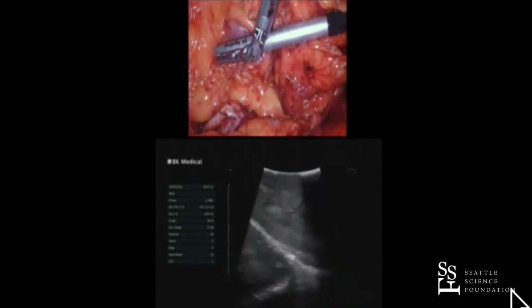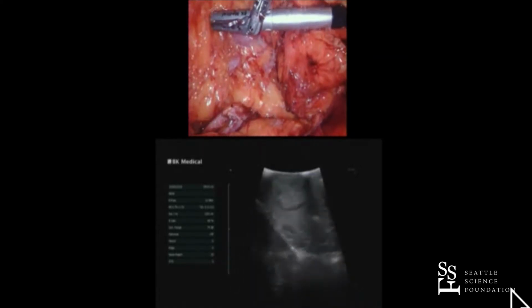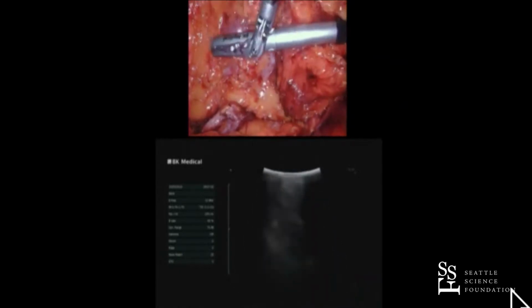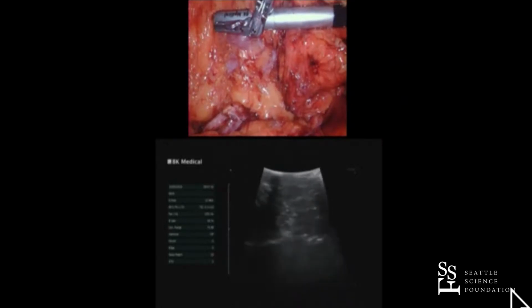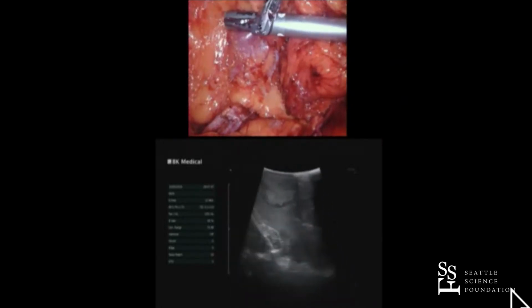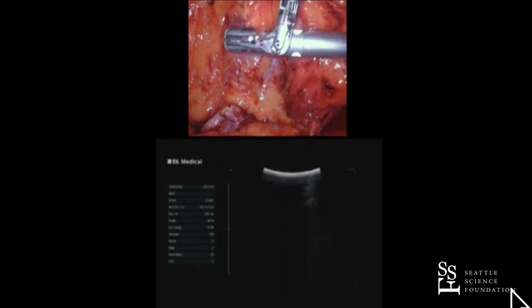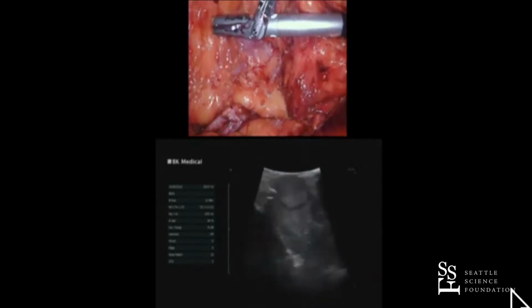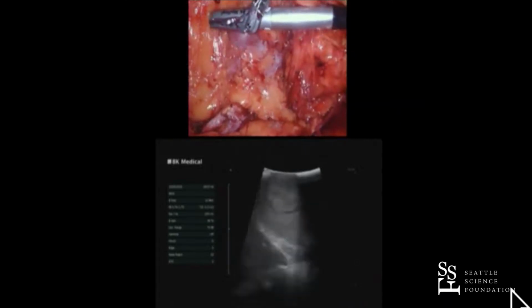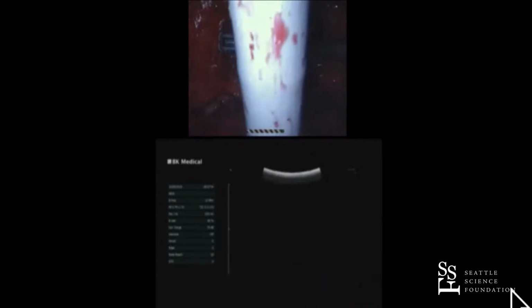So here's the tumor, clearly. This is really a nice tumor in the world of tumors. And it's towards the upper pole. So what I look for with ultrasound is the depth, where it is, and also I'm starting to get a sense of my margins. I can see this tumor, but if I had a big fat guy with toxic fat, I would be doing the ultrasound just to find out where I should go, because I don't want to get into the tumor as I'm going through the fat. So I do the ultrasound very early in those patients just so I know exactly where things are. Okay, ultrasound out.